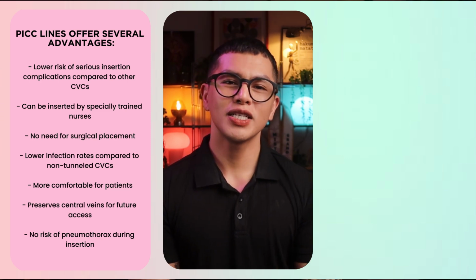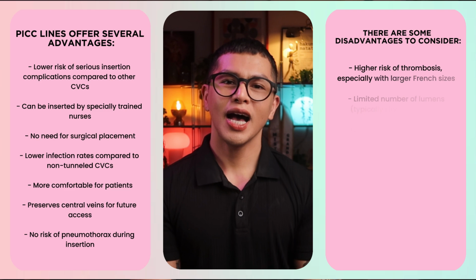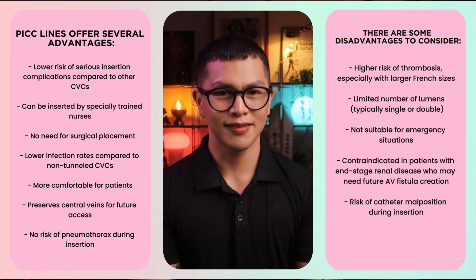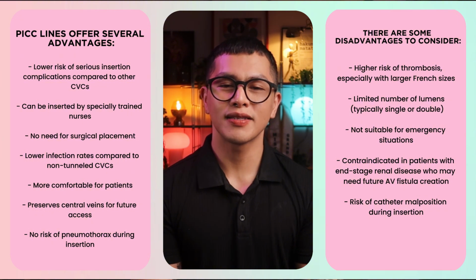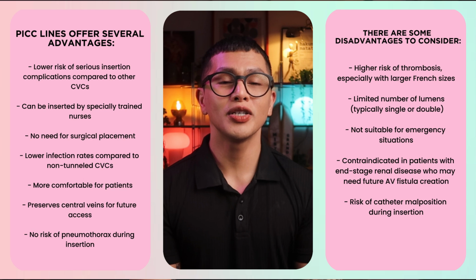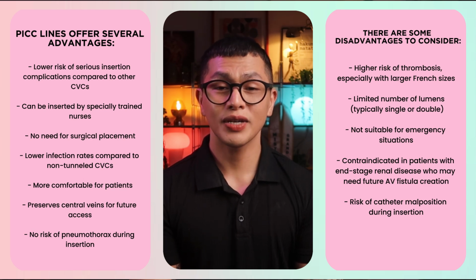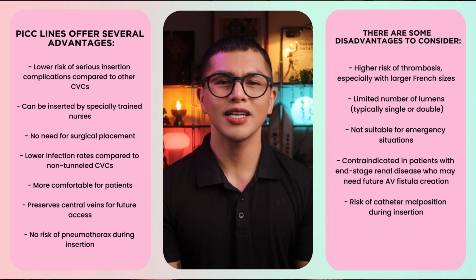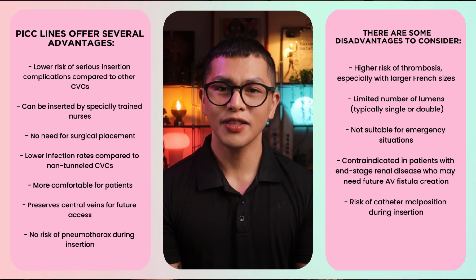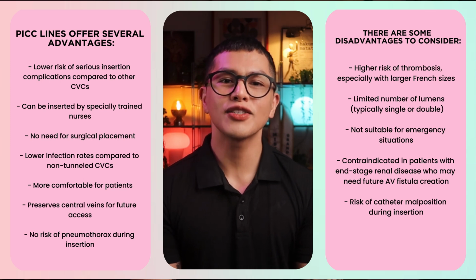However, there are some disadvantages to consider. Higher risk for thrombosis, especially with larger French sizes. Limited number of lumens, typically single or double. Not suitable for emergency situations. Contraindicated in patients with end-stage renal disease who may need future AVF creation. Risk of catheter malposition during insertion.